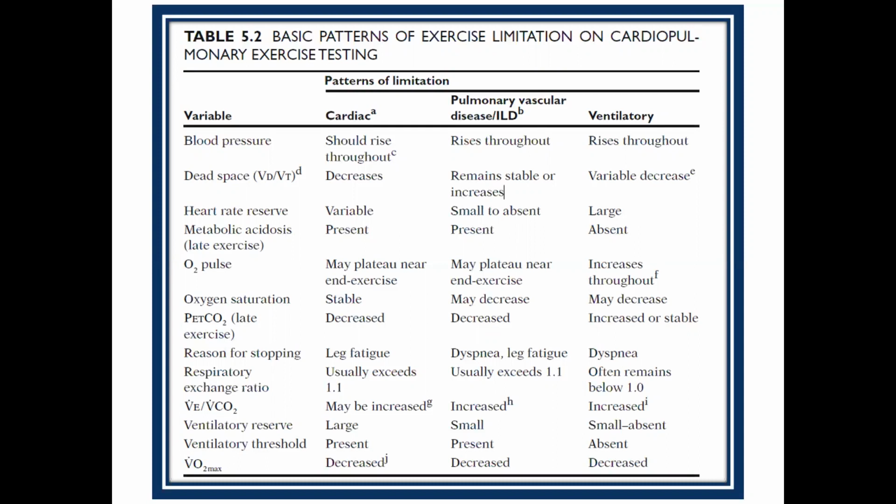It is not at all. That's why I try to explain it. It's ventilatory inefficiency. The higher the number, the more ventilatory inefficiency you have. And all it means is that gas exchange is not occurring properly. In other words, you have more dead space for the ventilation. So that can be from pulmonary diseases, or you're not getting enough perfusion to the ventilated areas, and that is because of predominantly RV performance at that point, which is a cardiac limitation.